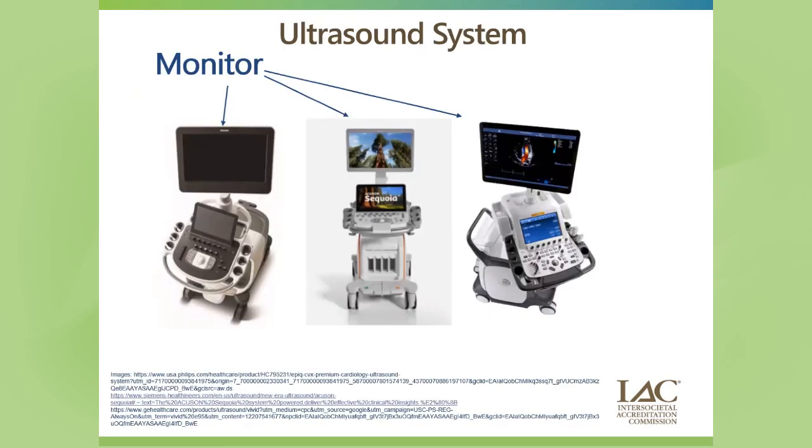So as far as our ultrasound systems go, I think we think of it as a whole, but there's three components that I'm going to more focus on. And one is the monitor. And that's one thing that's really easily moved up and down these days with our advanced systems. And then the next part we need to think about is the console, and where is it in relation to us? Are we able to move it forward and back or turn it, as you can see in some of these examples here, so that it is functional for the different positions we have to get in depending on what we're doing for our exam?